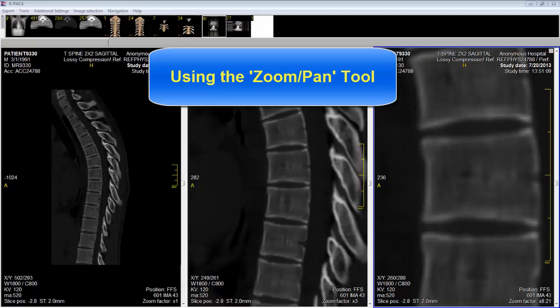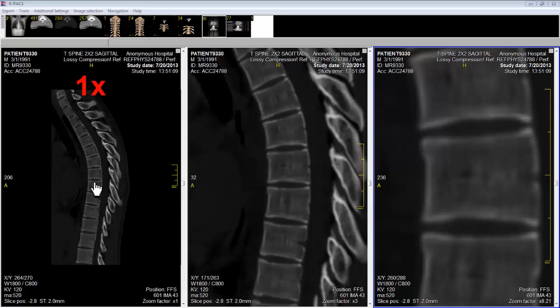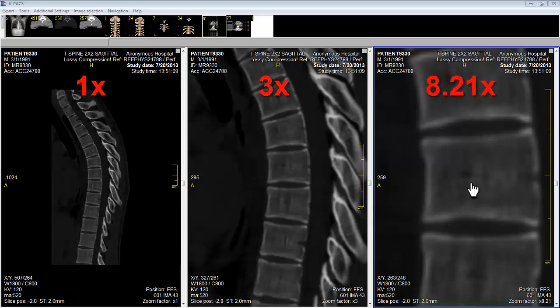In this tutorial I will show you how to use the zoom pan tool. What we are looking at is sagittal section number 43, displayed in three tile screens at different magnification. Windowing in each of the three screens is set for bones. On the left the tile screen has a magnification of one. In the middle the tile screen has a zoom factor of three, and on the right the image has a zoom factor of 8.21.